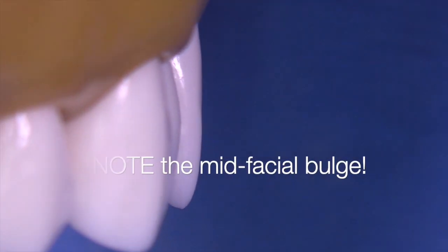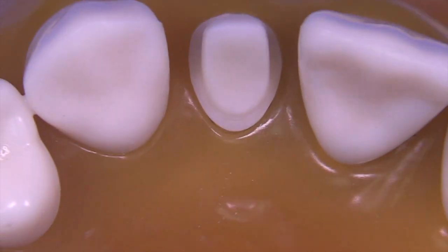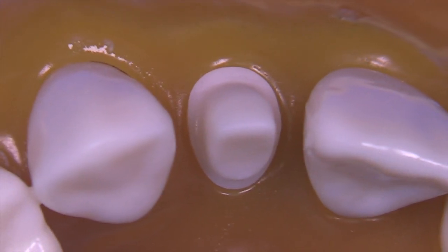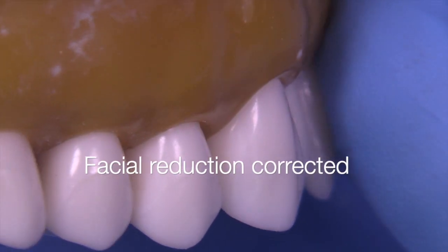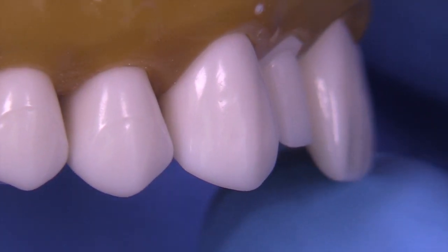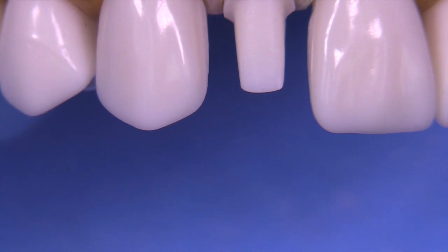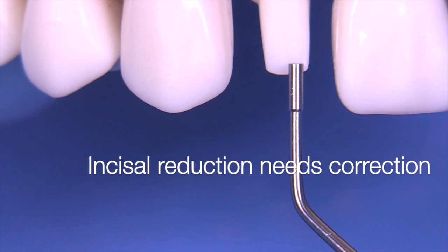Let's assess what we've got. I don't like that — look at that mid-facial bulge, that's got to go. And when I look from the incisal or occlusal view, the draw — the taper between the mesial and distal — is a little too tight, so we need a little bit more. You can see now there's been a definite change: the bulge has been removed and we've corrected the mesial-distal taper issue by allowing the bur to create the taper, or even tipping the bur slightly where something looks too parallel.